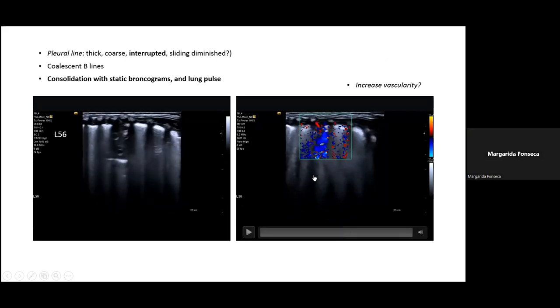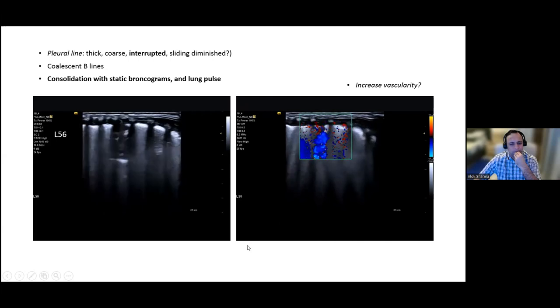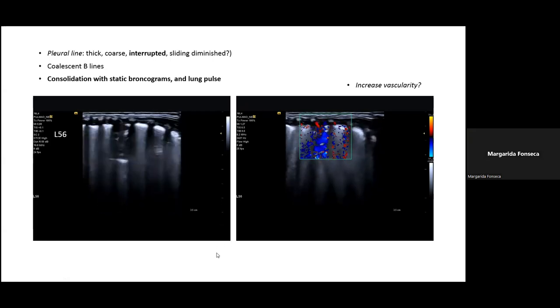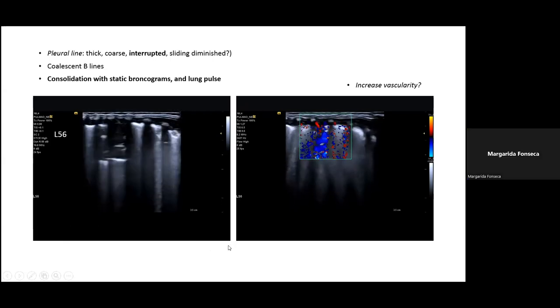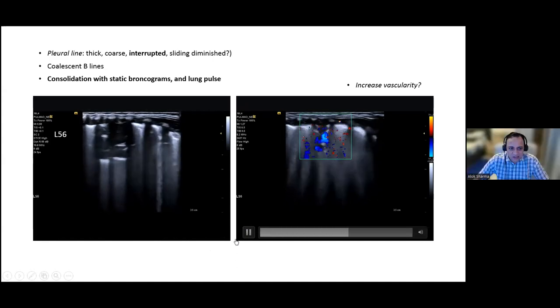If I go up, it gets all colorful. And I'm not sure that this is from the... Should I diminish or improve the gain of the color? You're just seeing what I call a speckling at that particular point. What you could do is try to reduce your color scale a little bit. Okay, when I reduce it, I think it disappears a bit. That's fine, so that would go against vascularity.